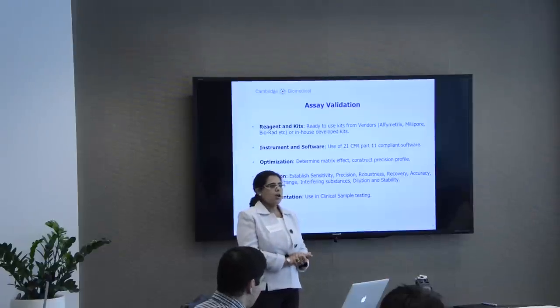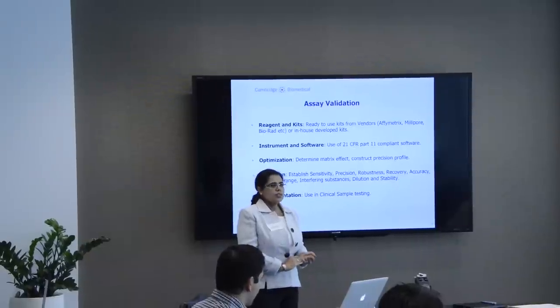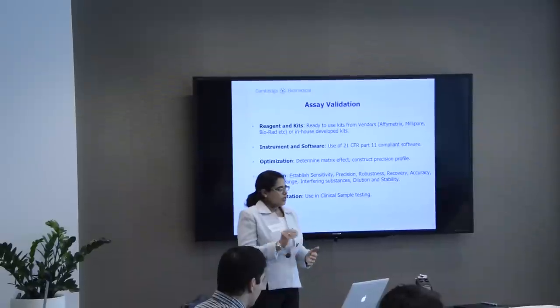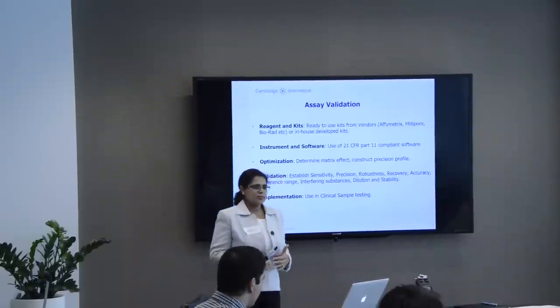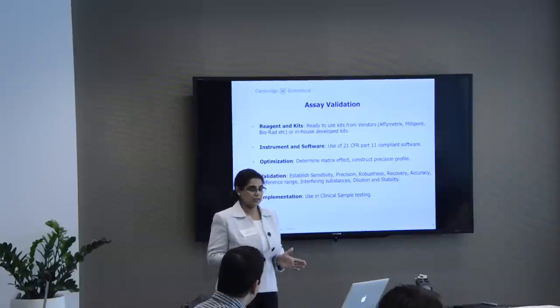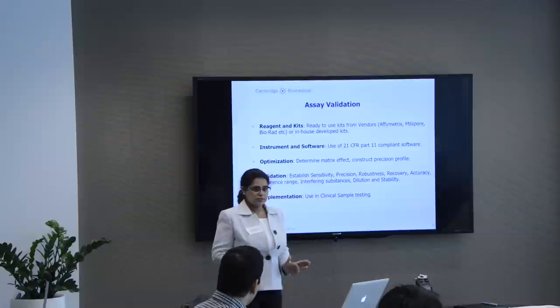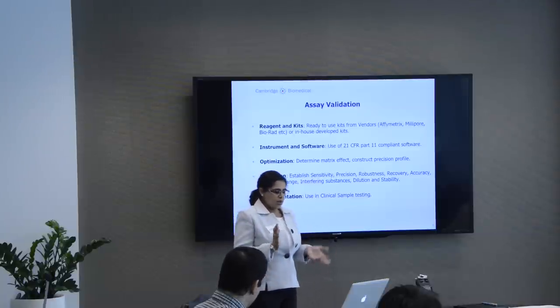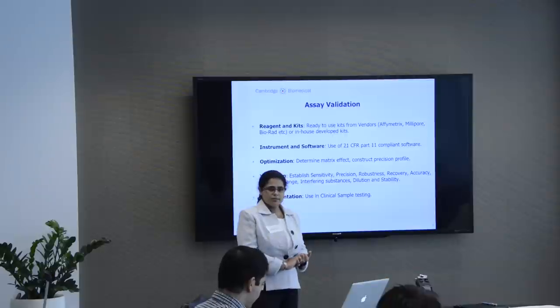You need to know, if you have a sample that you tested a year ago, and you test it a year later, did you get accurate, stable results or not? Very important. And then comes the implementation. After you validate, you need to implement the validated assay in clinical sample testing.